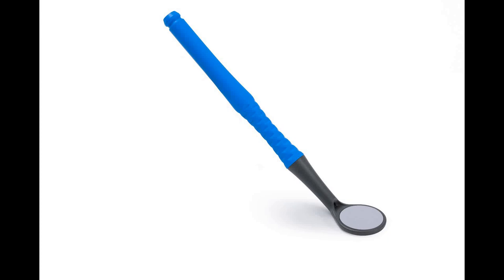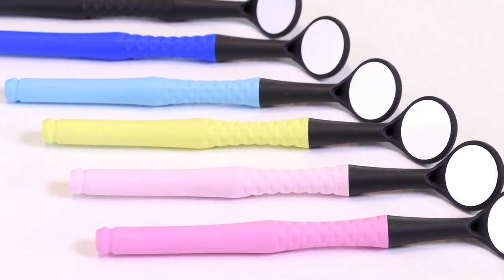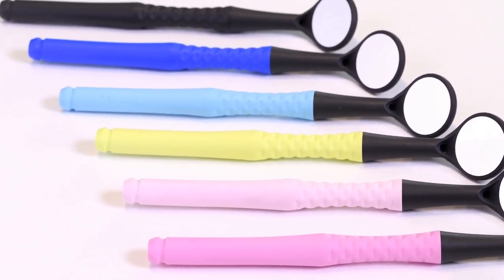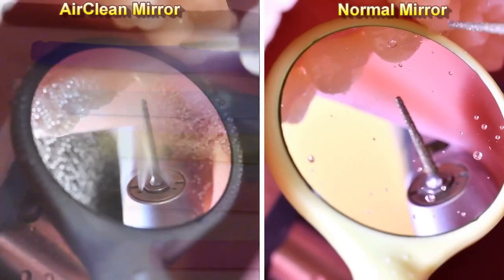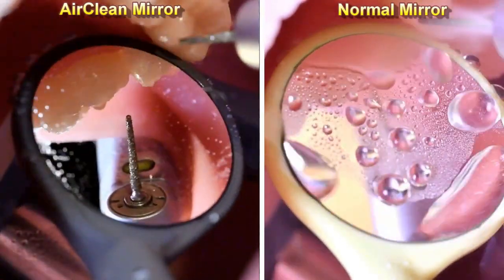This autoclavable, self-cleaning air dental mirror comes with ultra-high definition high reflectance lenses, giving you great visibility and perfect color reproduction. Front surface unique alloy coating offers high scratch and chemical resistance, as well as being water repellent.